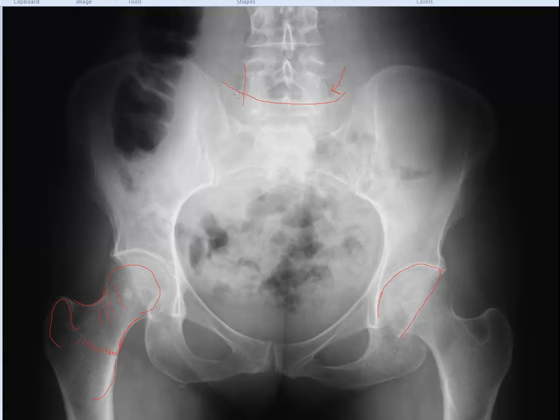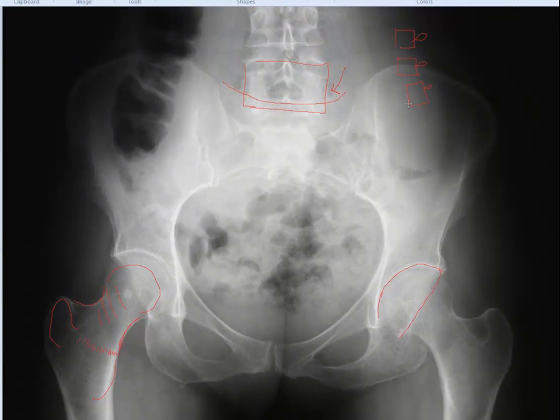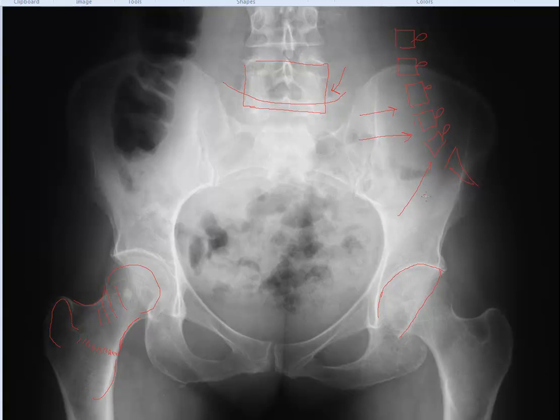The L5 vertebral body is positioned slightly inferior because on a lateral projection L5 is more downwardly oriented, so on a pure AP projection we don't typically see the L5 body very well. The purpose of the lumbosacral spot projection is to tilt the tube roughly 25 to 35 degrees in an AP projection and really see through that disc space as well as the structures surrounding the L5 and S1 segments. On the AP projection of the pelvis you can see the posterior arch, lamina, and spinous processes, but not the body extremely well — hence the need for the angulated spot projections.